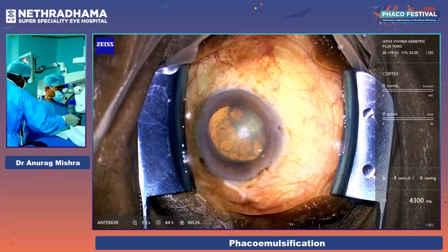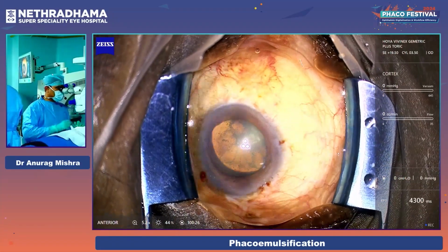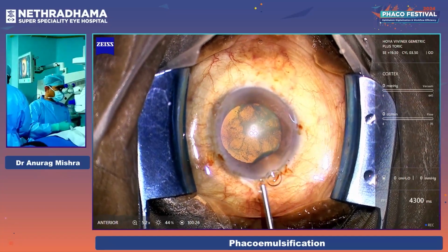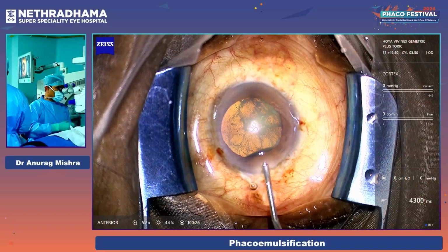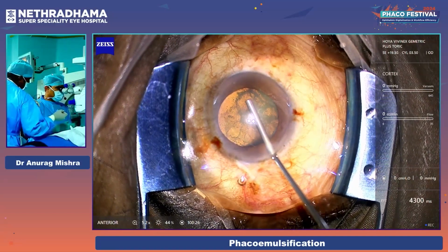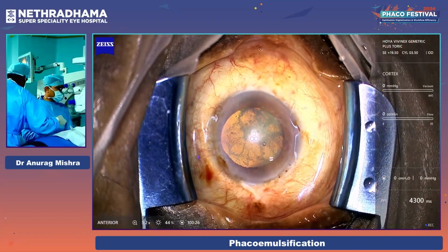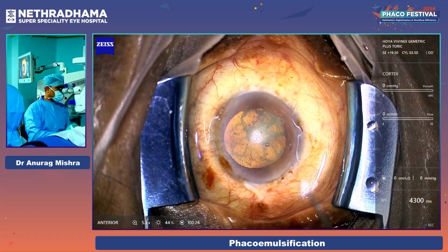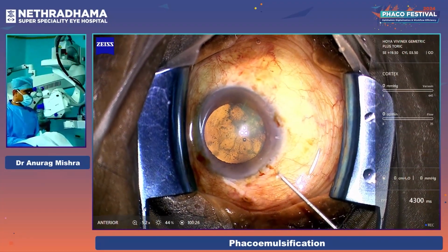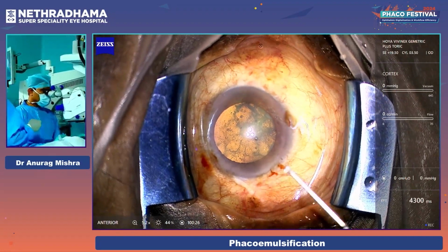Please let me know if the eye shifts from focus and I need to rearrange the focus. Look straight, sir. For viscoelastic, I would be using HPMC alone, no other viscoelastic. The technological difference in the designing of the IOL that Naren just implanted, which was the Panoptix, and the Geometric would be something we would be discussing. Look straight, sir. Can somebody help me with the language, please? Can you ask him?